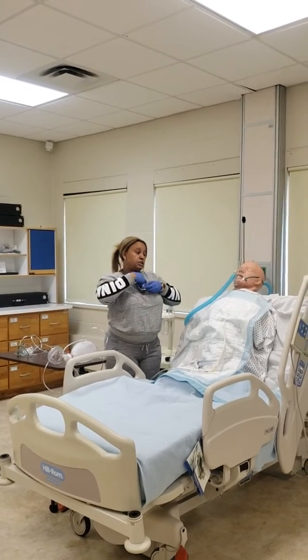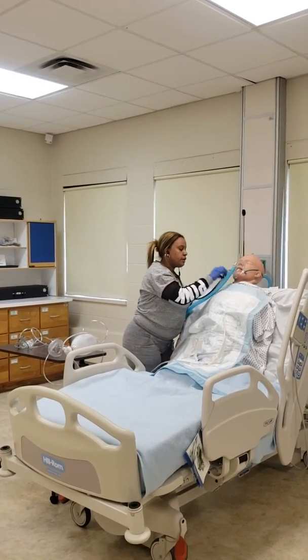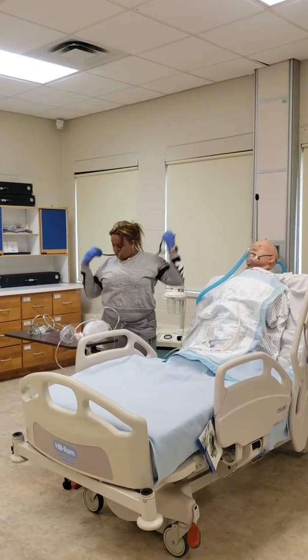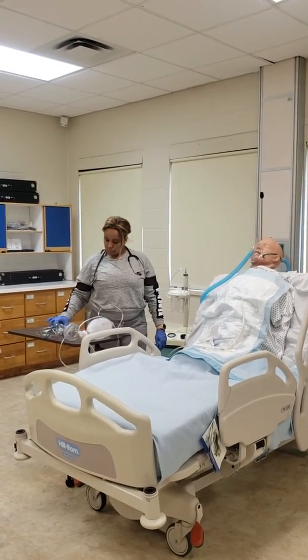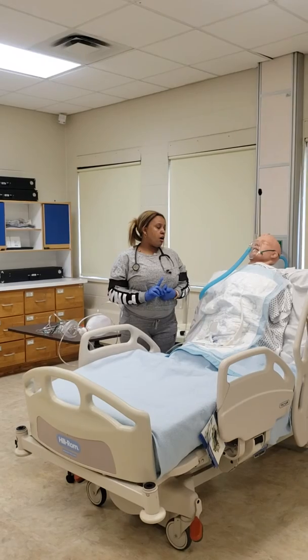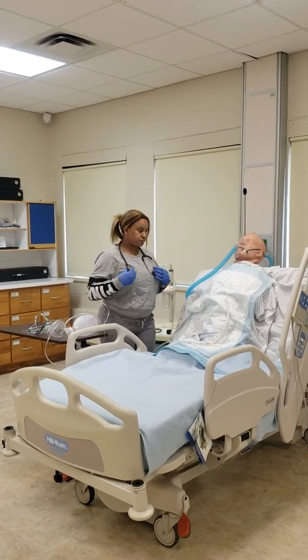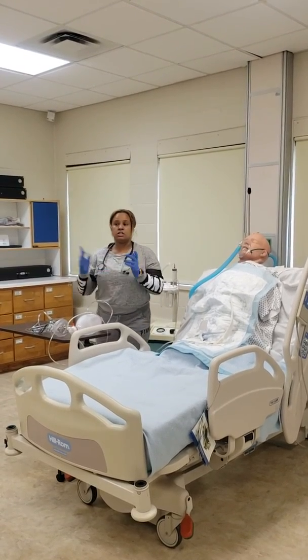I'm going to listen for stridor and listen for bilateral equal breath sounds. If stridor is present, then I will use my small volume nebulizer and give a racemic epinephrine treatment. I will now assess the patient's blood pressure, heart rate, saturations, respirations, and color. I will now clean up my mess, wash my hands for at least 15 seconds, and document in the patient's chart.